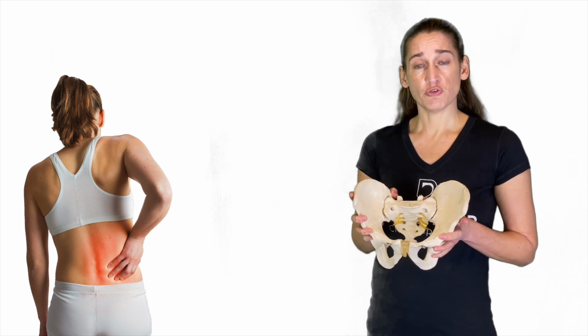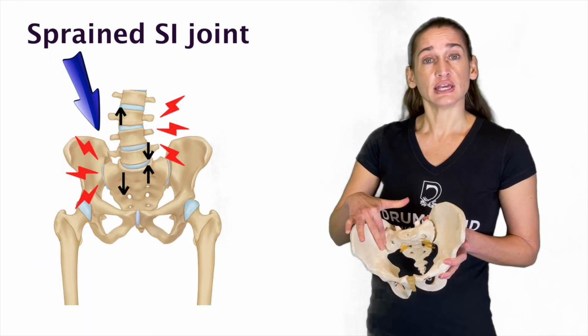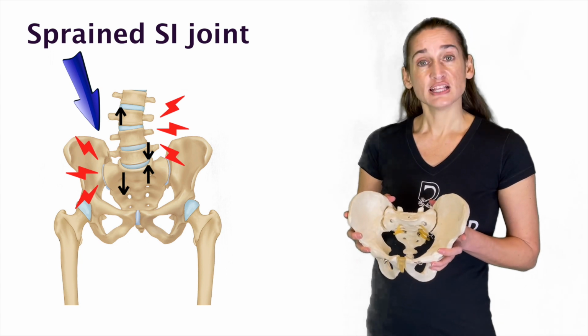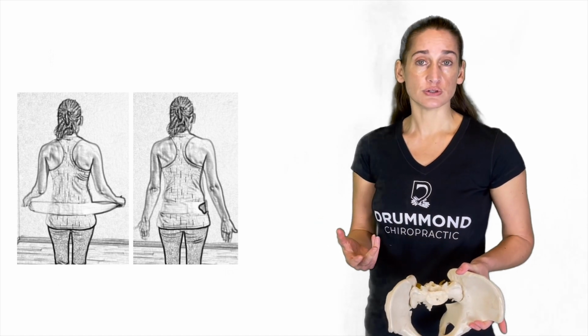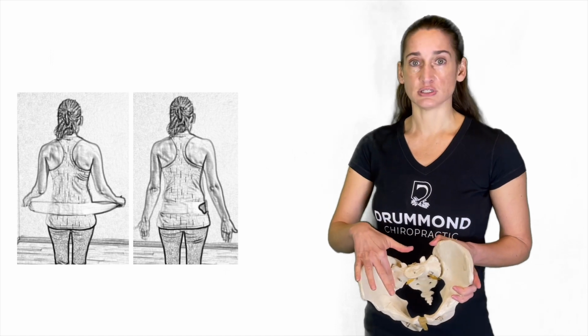And if you do any movement that reopens and resprains that joint, then it's not going to heal. It just keeps re-tearing with every movement. And that's why I prescribe an SI belt. Now, typically I don't like bracing because I want your own muscles to get strong and stabilize you.